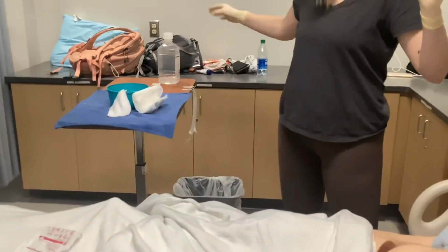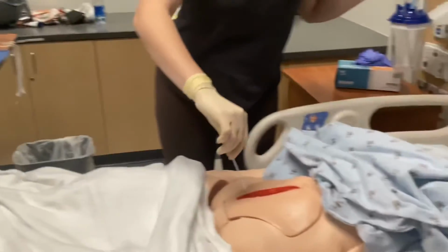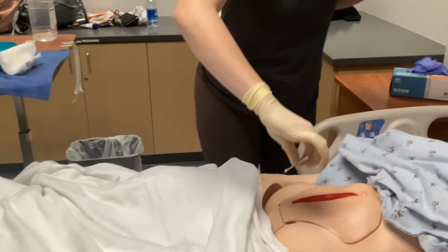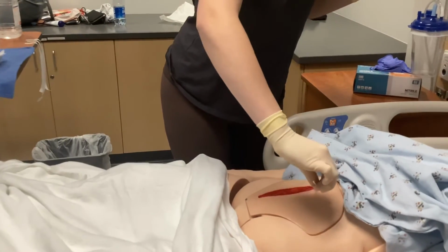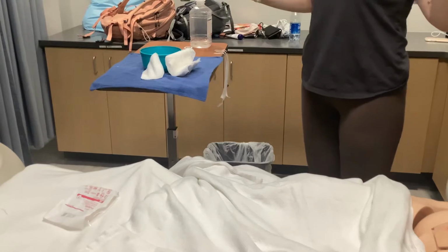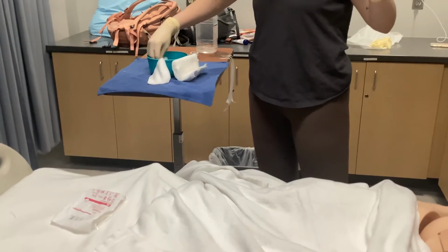So discard, grab a new swab. Discard, grab a new swab. On the outside I might have to use a little bit more pressure to get any excess. Dispose. And now I'm going to pack the wound. My gauze.